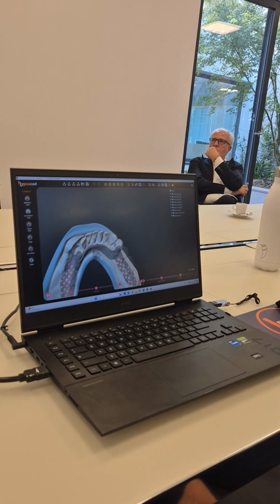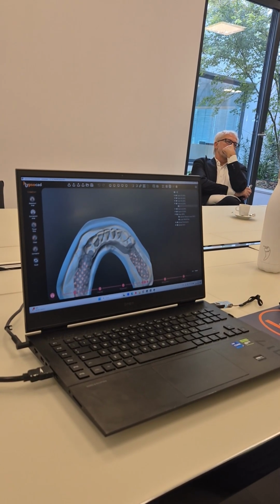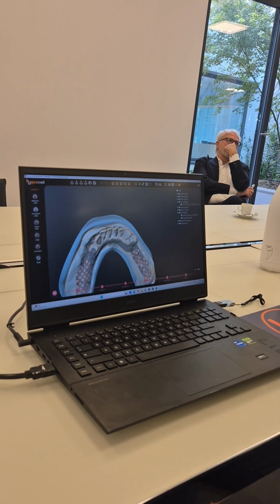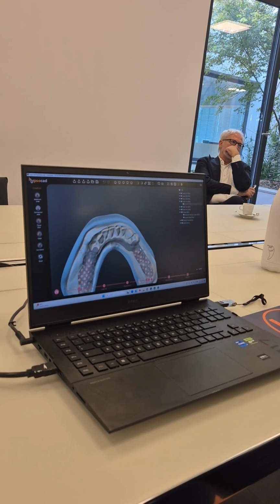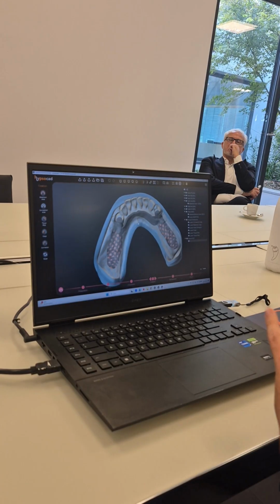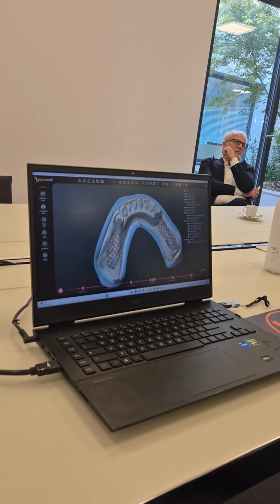Sorry, I miss a bit the latest ExoCAD version for this part. Is there any development for that? Because I remember 3 or 4 years ago when I tried this, it was terrible work. Do you know if now it is a different ExoCAD, or has better development? Yeah, it is a new workflow for our software. If you want, I can show you a real case.